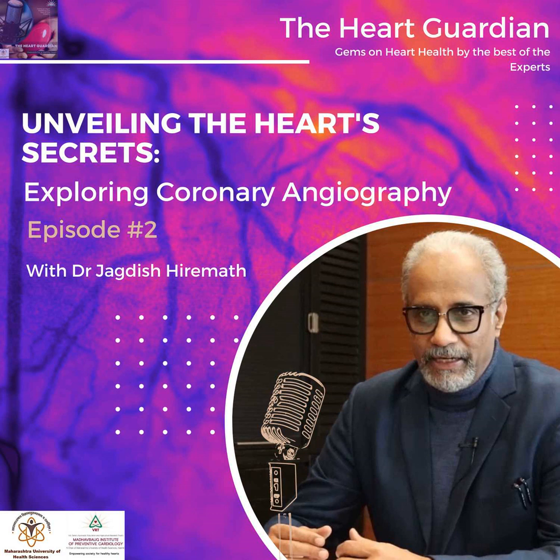During training as a cardiologist, the earliest procedure that is taught is the coronary angiography. This shows us how easy the procedure has become over a period of time. It can be done in acute heart attack, it can be done at all age groups, it can be done years after a bypass surgery.